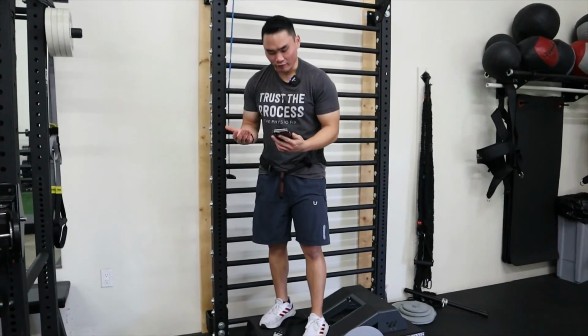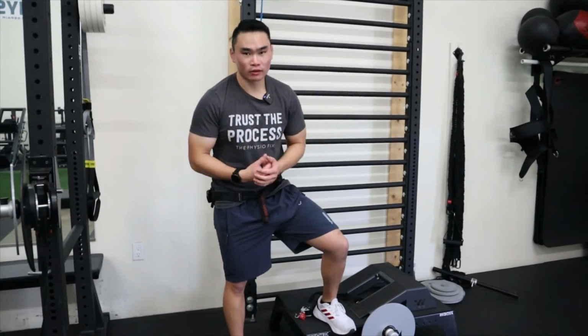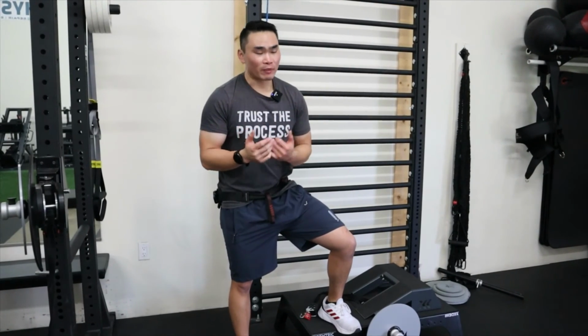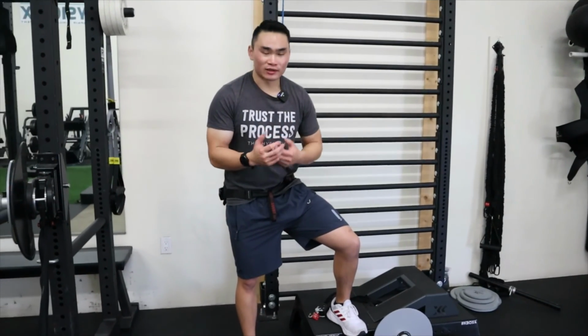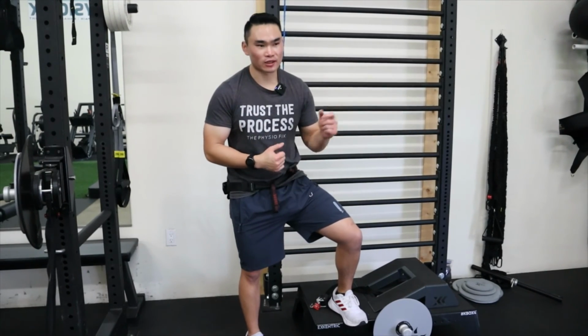Now, obviously, we're not going to have them push their limit literally every rep, every set, or every session, but it can give me an idea of maybe, hey, my patient might be a little bit more fatigued. It might be a good time to throw in a deload or a pivot week. Or I can just say, hey, we've got to get after it, we've got to get these velocities up.